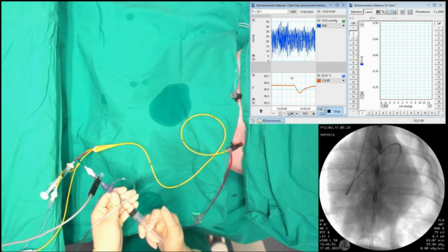So you'll get a steep decrease in temperature when you quickly inject your cold saline, and then temperature will slowly recover to normal values. And using this temperature change, then you can analyze your cardiac output either using your clinical monitor or the LabChart module to analyze cardiac output.